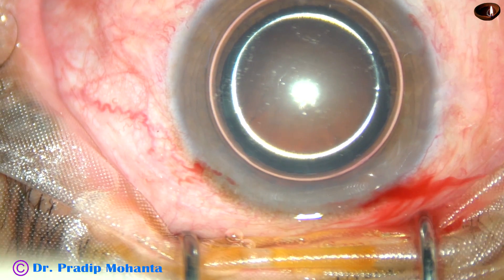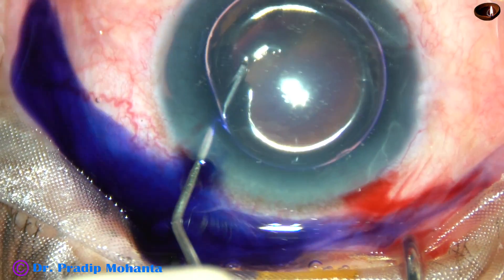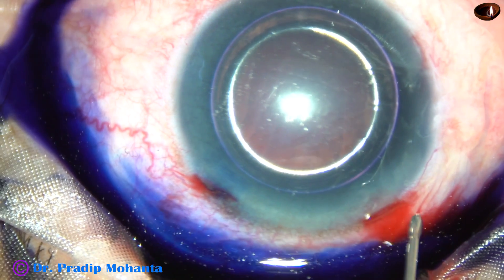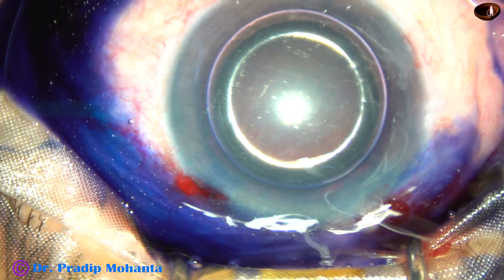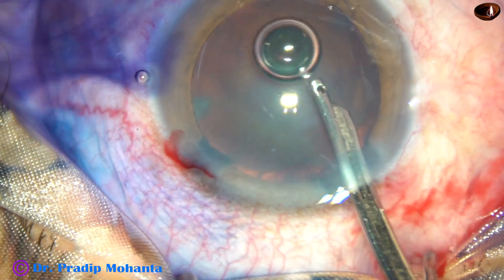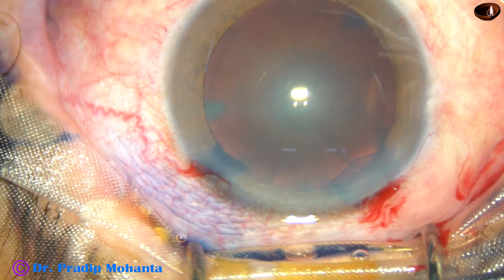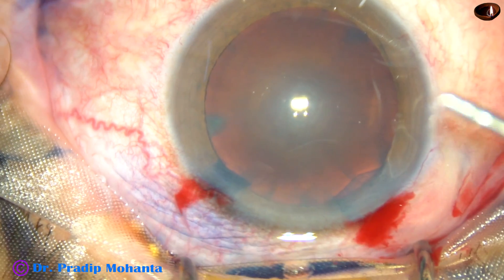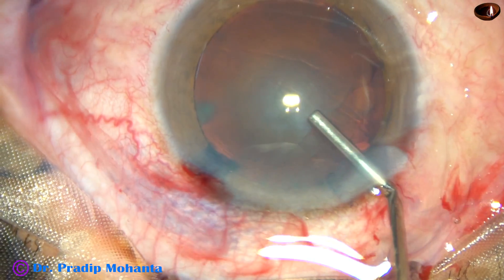In this case, the capsule is being stained with trypan blue dye underneath an air bubble. Take care to touch upon all parts of the anterior capsule so that staining becomes uniform. Then wash the dye using Ringer's lactate or BSS. Then use whatever viscoelastic substance you want to use — in this case, 2% hydroxypropyl methyl cellulose.